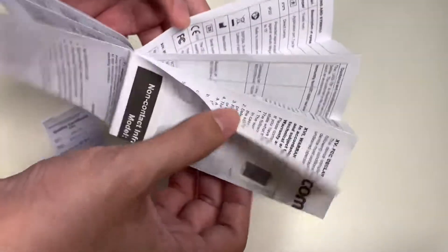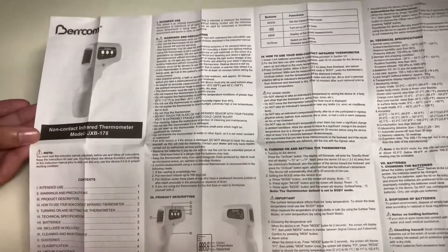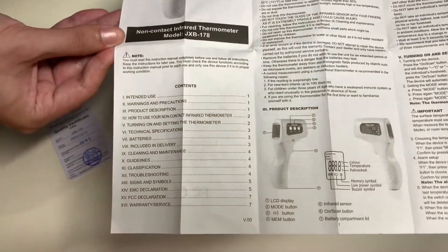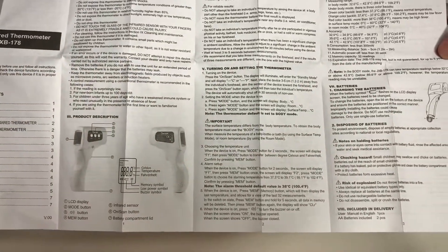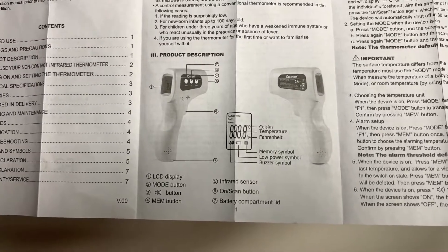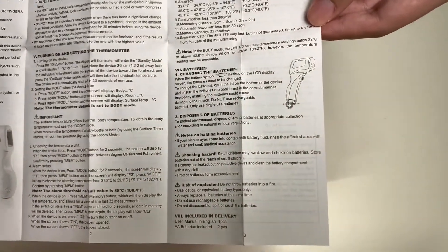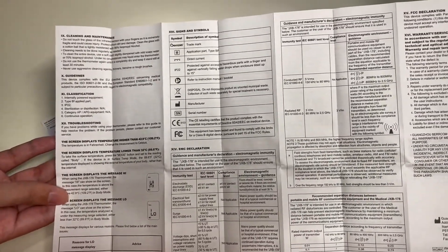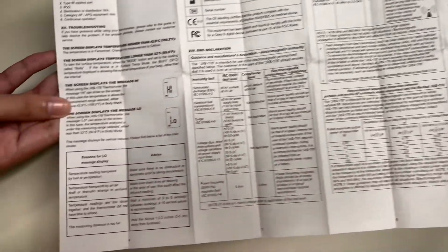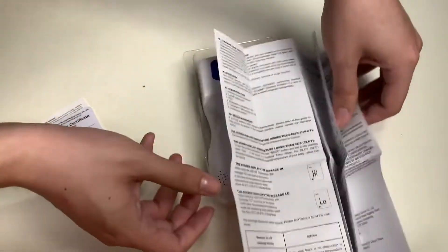Here is the fold-out manual which we'll take a quick look through for those interested in how this functions. Here are the contents — you can pause the video if you want to read specific information. Here's the product description and its functions. The thermometer takes batteries, and batteries are already included. Here are the screen displays and messages, along with the reasons for each display message.